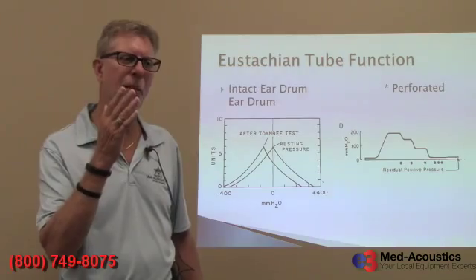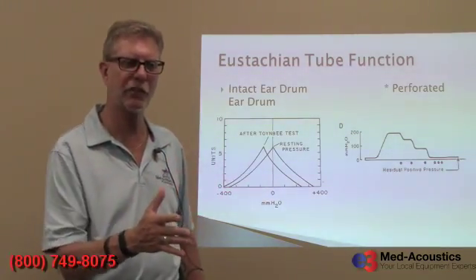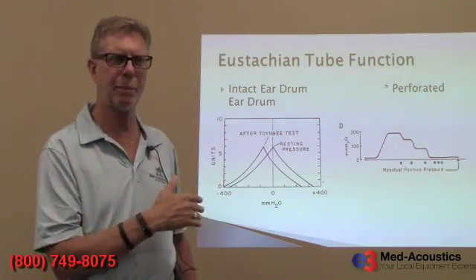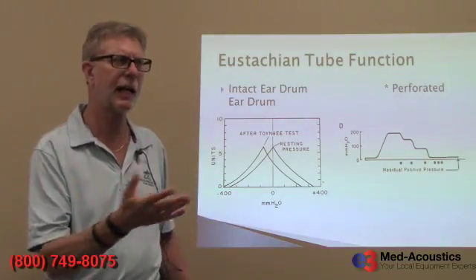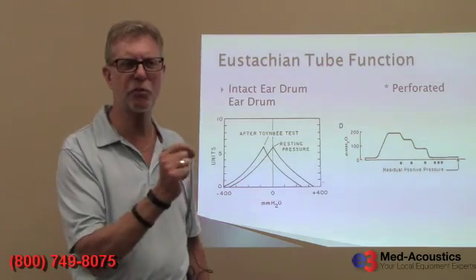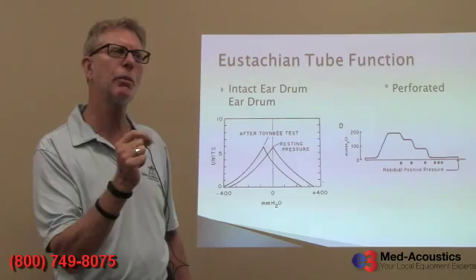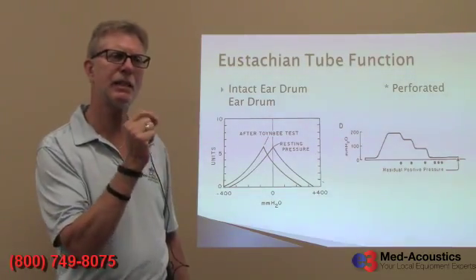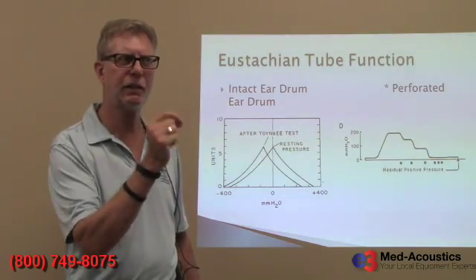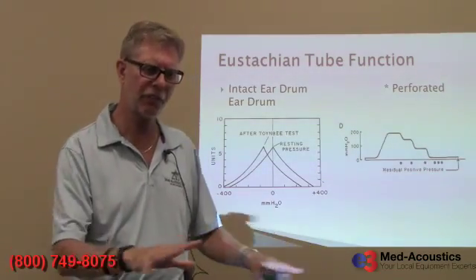In other words, doing tympanograms not just at 226 hertz or even 1000 hertz, but what if you did it at all frequencies in between, maybe in 1/3 octaves, between, say, 200 hertz and 2000 hertz, and you found the resonant point of the middle ear. That can help you determine and pin down exactly what is causing the pathology better than a tympanogram at a single frequency. But that's the subject of another session altogether.